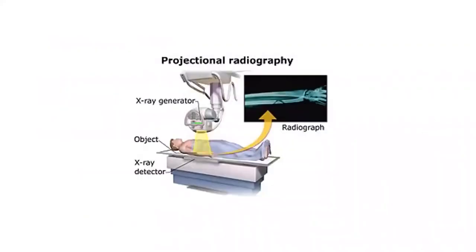And basically, when you think about a conventional radiograph and how it's acquired, you got your subject position. There's lots of different ways to position people to get the right view of a joint or a limb. And usually we want to get more than one projection. The rule in orthopedics is if you have one projection, you have no projections, because you can't comment effectively on what the body part looks like without having at least two projections.